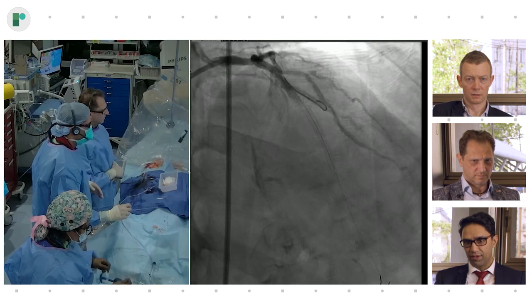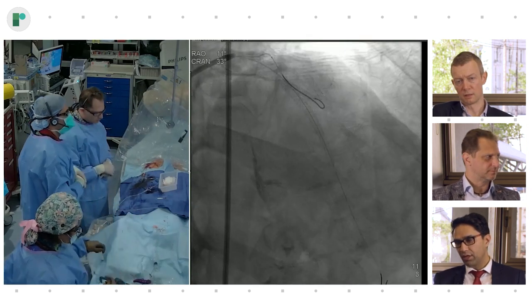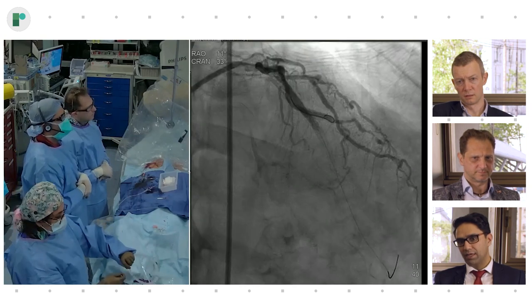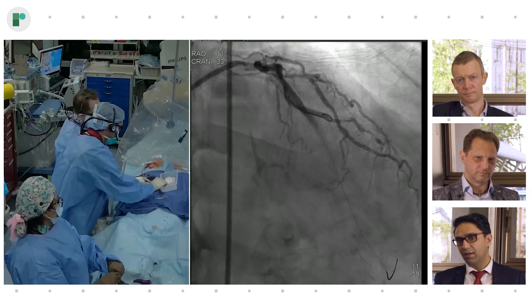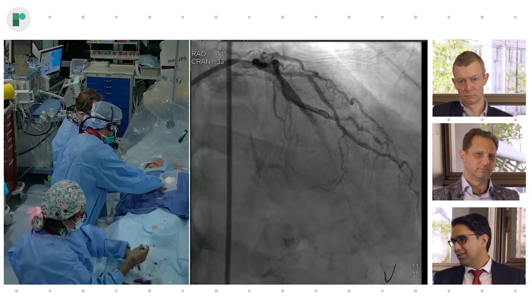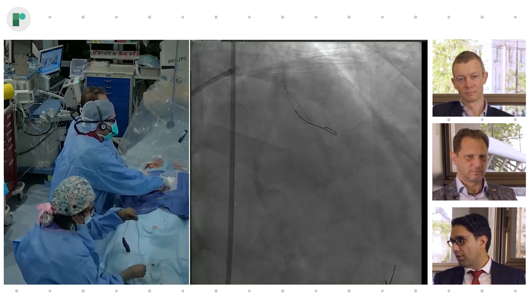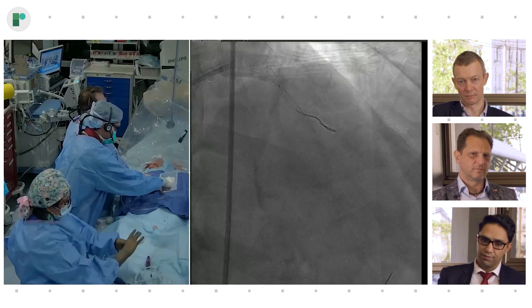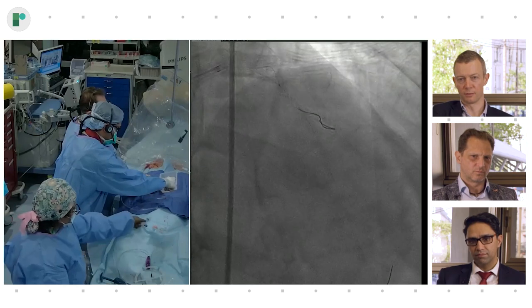So here we take, I think we're going to take a proper picture. And this actually helps a little bit. It helps a little bit because this looks like there's basically slow flow all the way down the artery, and the contrast actually stops before the end of the stent. So what this told us was that maybe a little bit of drugs here, a little pharmacology, can help open the distal vessel. I mean, there's no price for that, right? I mean, you can just try and see what it does.